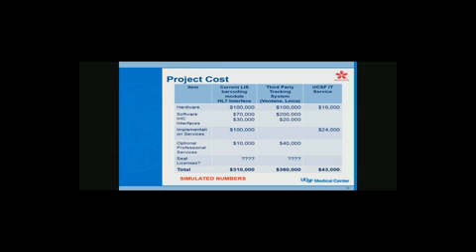But as you can see, the cost is pretty similar, and a couple of things came up that turned out to make the Ventana and Leica systems not a good deal for us. During the 2-year time period that we spent investigating the systems, CoPath upgraded their system enough so that it was pretty much a match for either Ventana or Leica.